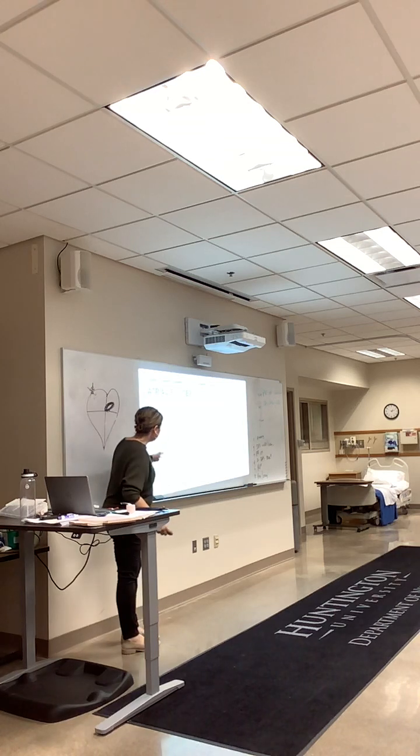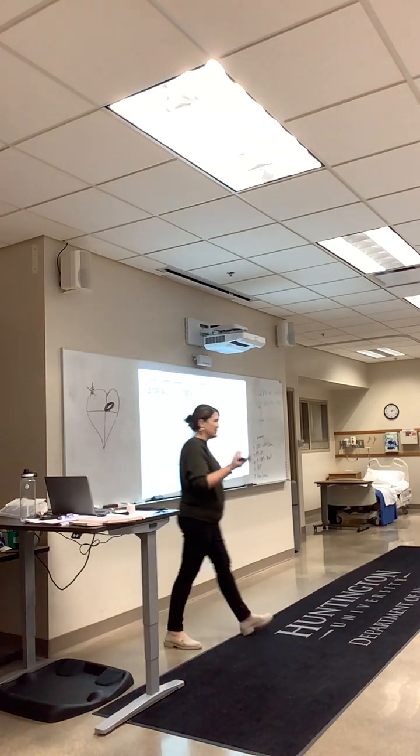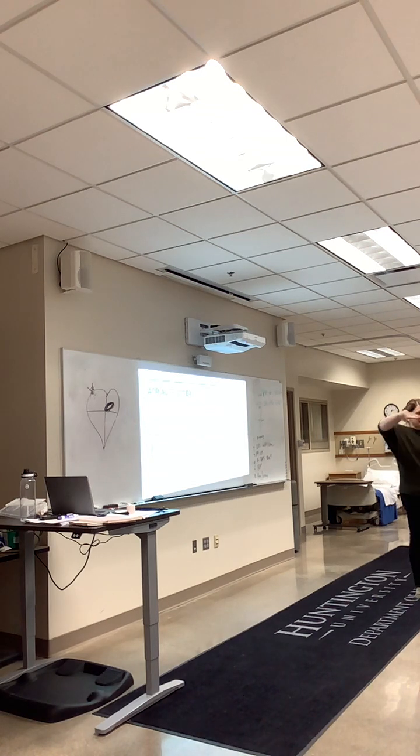So the flutter waves. Now sometimes you think, wait, isn't that a T wave, a QRS T wave? Well, there's extra waves in there. Sometimes if it's going fast enough, it's hard to tell. But you'll see it's like a sawtooth pattern that's consistent throughout. And we'll have some practice ones to look at.